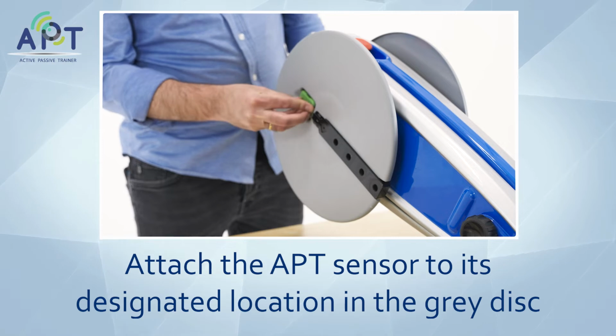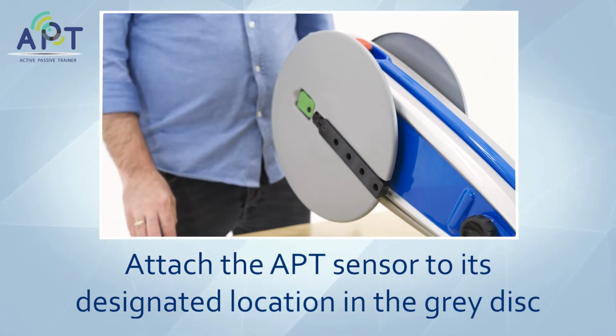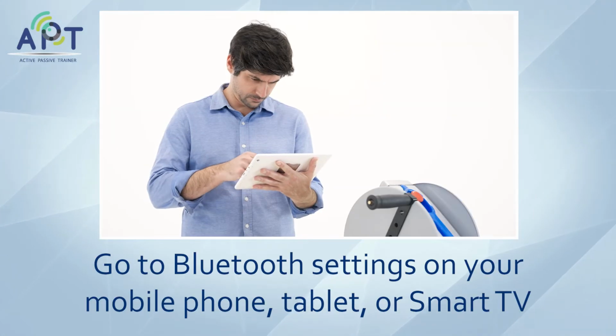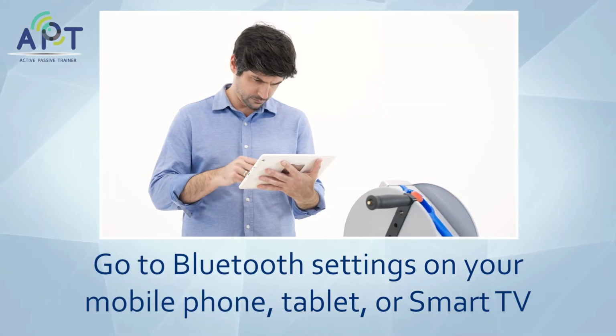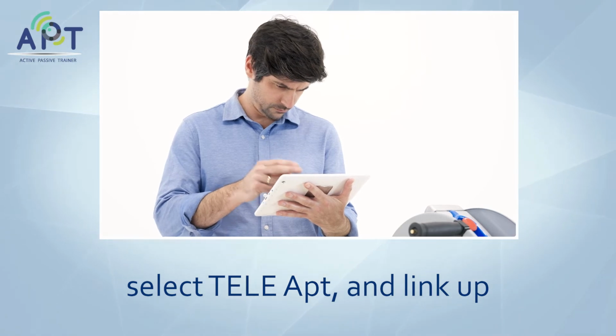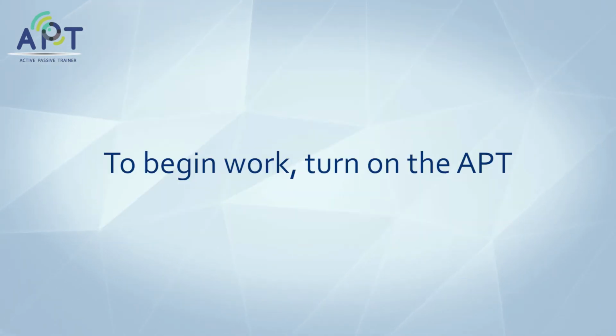Attach the A.P.T sensor to its designated location in the gray disc. Now, link up the A.P.T sensor and the Tele A.P.T app. Go to Bluetooth settings on your mobile phone, tablet, or smart TV, select Tele A.P.T and link up. To begin work, turn on the A.P.T.